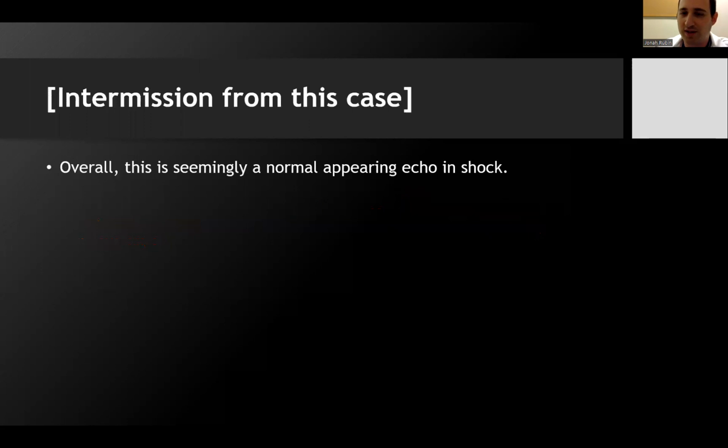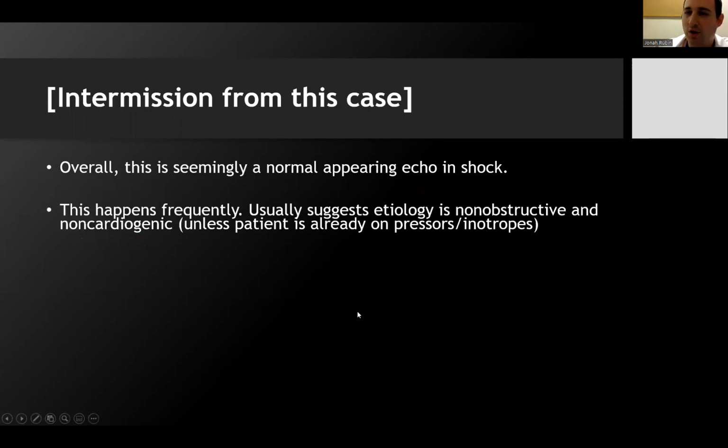And the truth is that I want to take a moment, pause from this case and share that this is a very normal appearing echo in shock. And this happens all the time, right? I would say probably 80% of the time, your echo is not really going to necessarily help you figure out your cause of undifferentiated shock. When you find some great finding that can guide your next steps, that's amazing. And because it's so easy and free and risk-free, we should be doing this all the time, but I'm not trying to tell everyone that every case of undifferentiated shock is going to be solved with the echo.